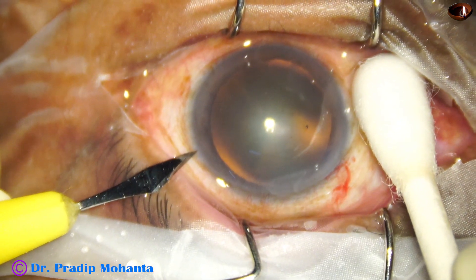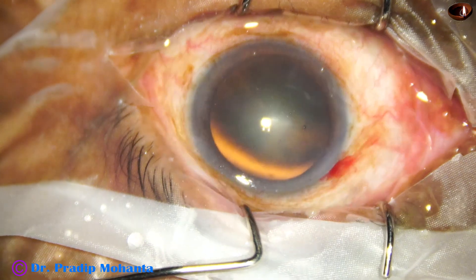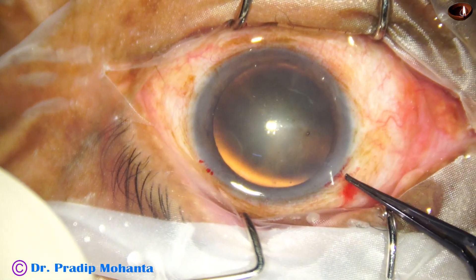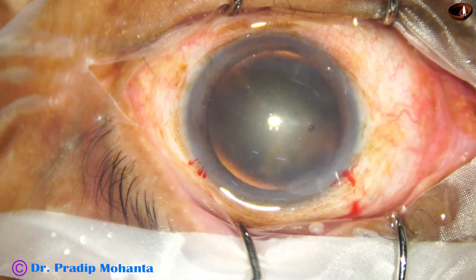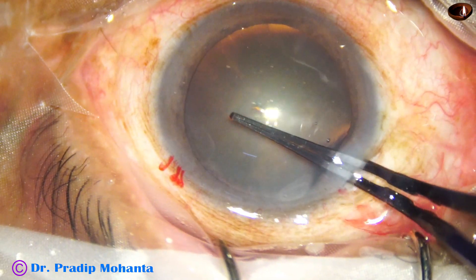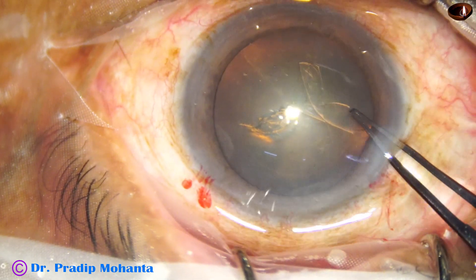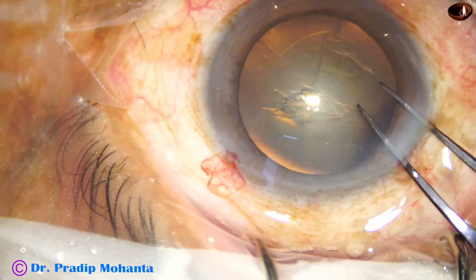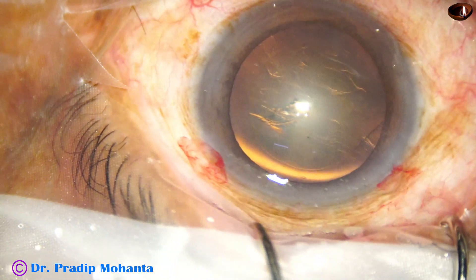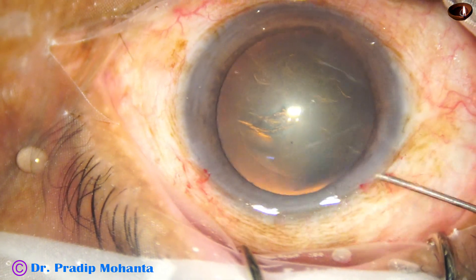A side port is made on the left side of the main incision, about 3 o'clock hours away. Now capsulorhexis: with the help of utrata forceps, the utrata goes in, pierces the center of the capsule, and a capsular tag is raised. This capsular tag is guided anti-clockwise all around to get an adequate size rhexis of about 5.5 millimeter.